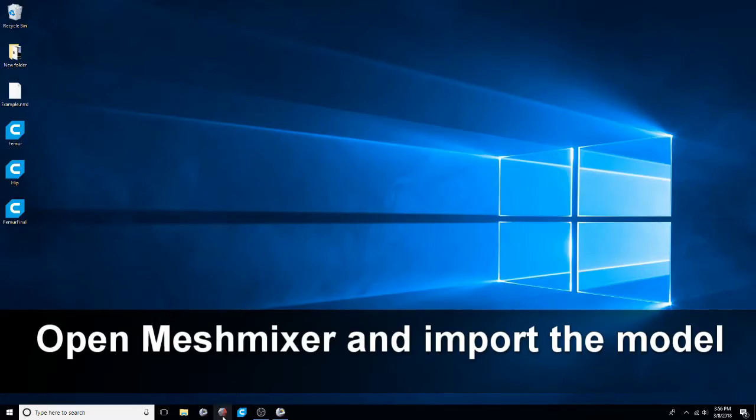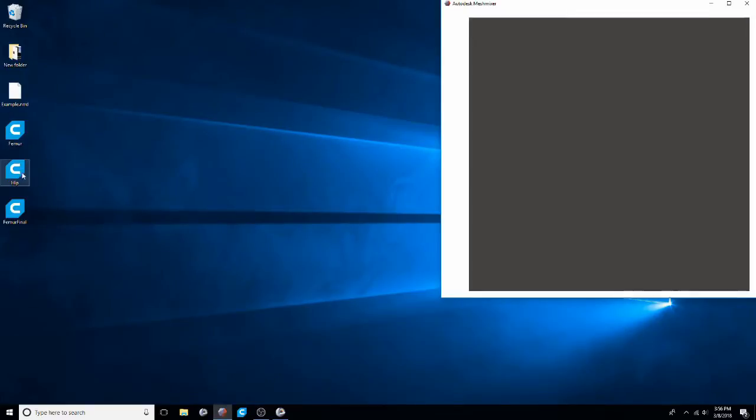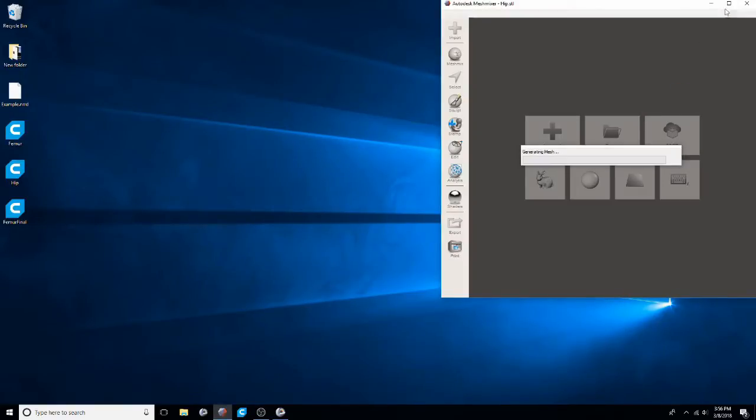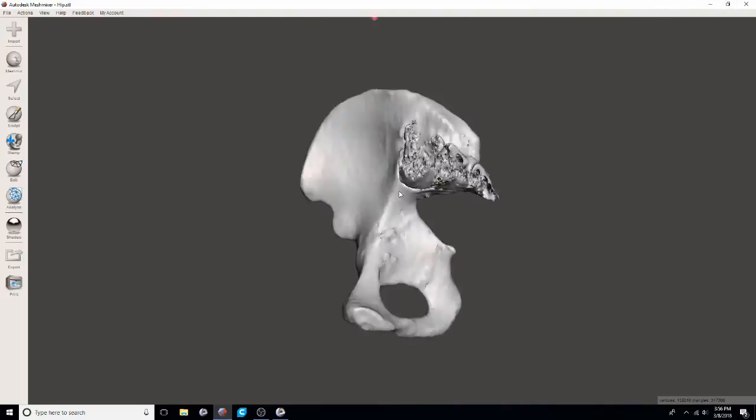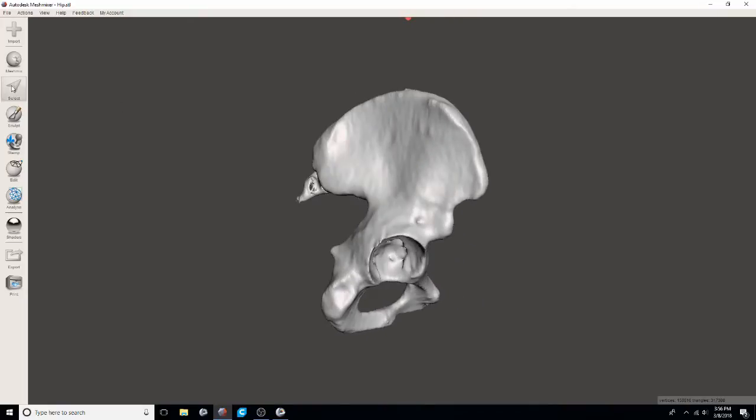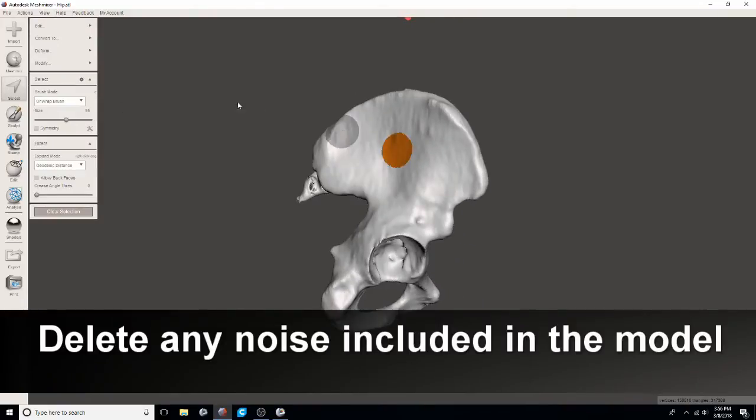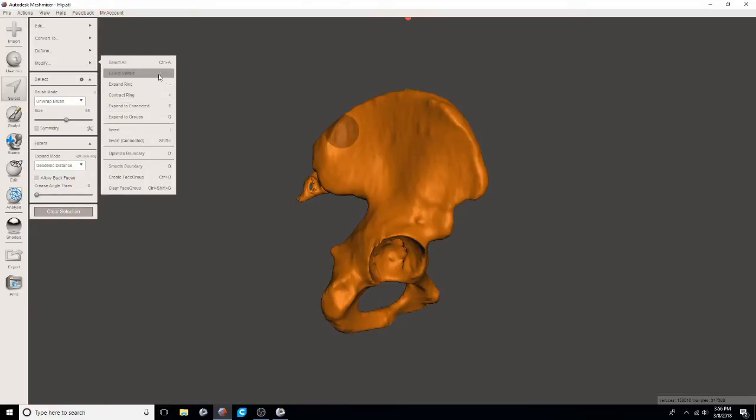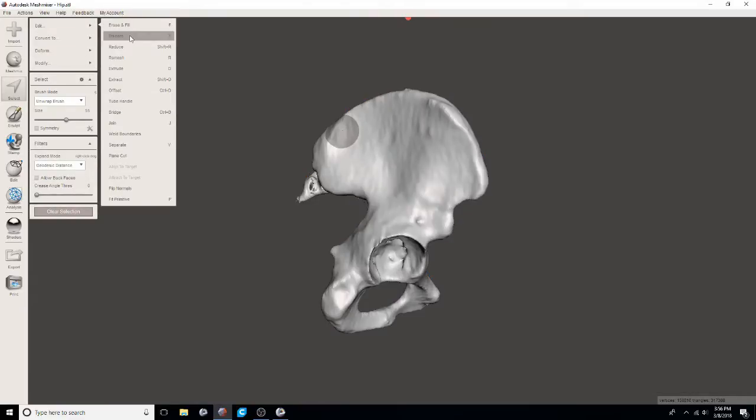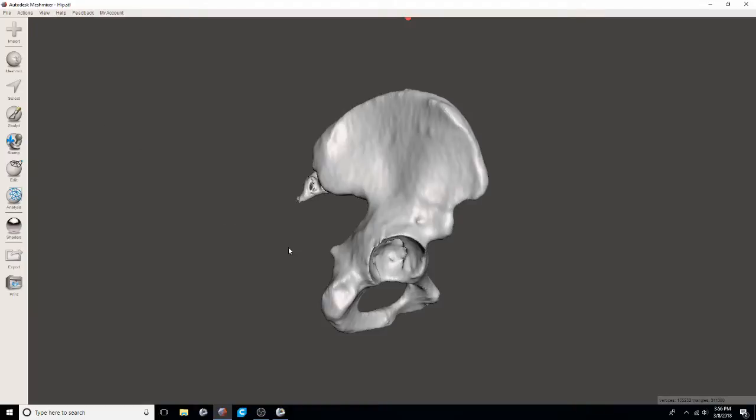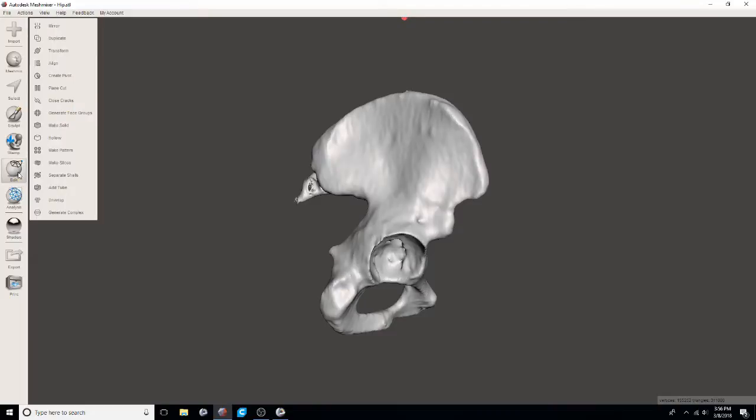We'll open up mesh mixer so that we can edit these models a little bit. You'll select a part of the model. Go to expand to connected. And then you'll invert that so you're selecting everything that's not touching that big model of the hip. And then you're able to discard it so that you don't have any sort of noise or little other portions of model that you don't really want.